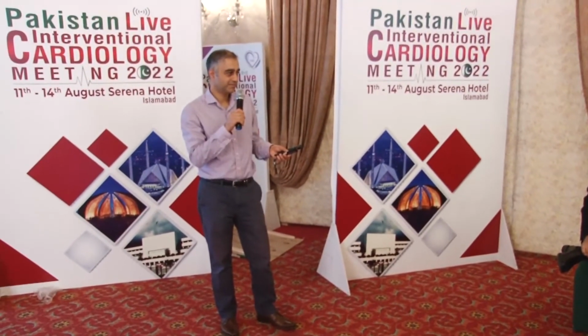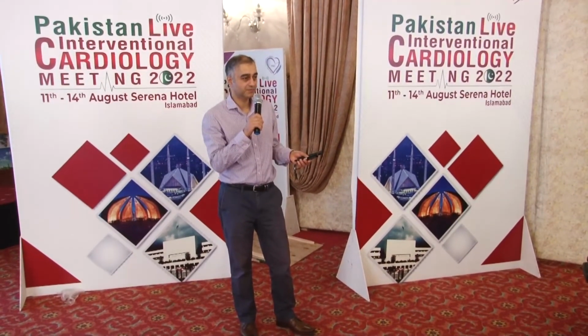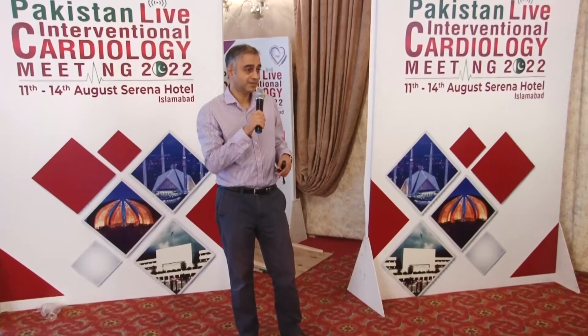But remember, we have revascularization guidelines based just on areas of the lumen, right? So you've got the 6 millimeter and the 4 millimeter. You're well beyond that. That's 6 millimeter squared, when you start just thinking about left main revascularization, or 4 millimeters in the LAD. So these are all things that you learn as you start using the technology. If you don't use it, you'll never think about these things. I think that's an important point, actually. If you're bringing out the technology at the time when you're not quite sure what's going on, then that's probably the wrong thing to do, because you need to familiarize yourself with how to set it up, etc.